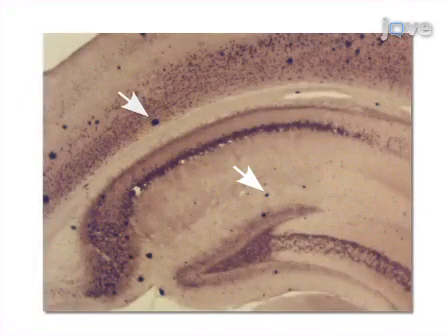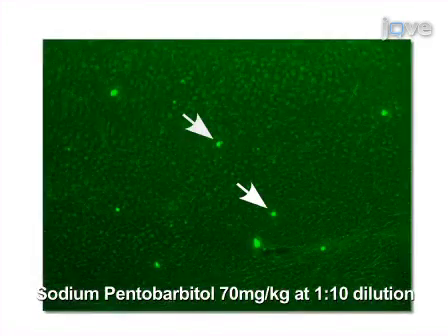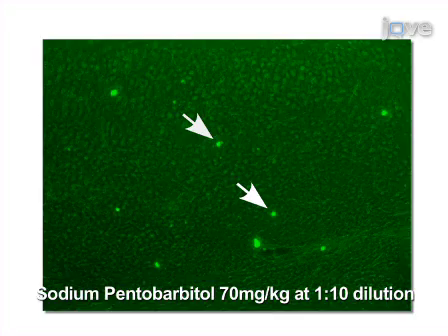In our recent study on the efficacy of the anti-epileptic drug and mood stabilizer valproic acid to inhibit neuritic plaque formation, we used the above-described immunostaining and thioflavin S staining procedures to identify neuritic plaques in AD model mice. A typical 9-month-old APP23 transgenic mouse is stained with anti-A beta using biotinylated 4G8 and detected via the ABC method. Neuritic plaques are clearly labeled with the antibody and are indicated by the white arrows. Here, thioflavin S staining detects neuritic plaque deposition in 2-month-old APP23 x PS transgenic mice.